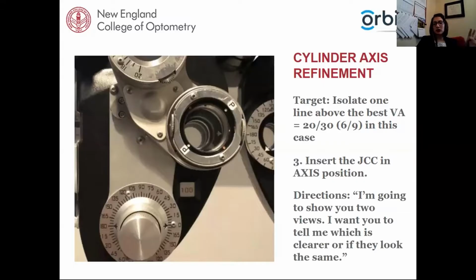So now that was our initial sphere check. Now we're ready to start refining the cylinder. And so there's two components to this. The first is refining the axis. The second is refining the power. So we're going to start with the axis.